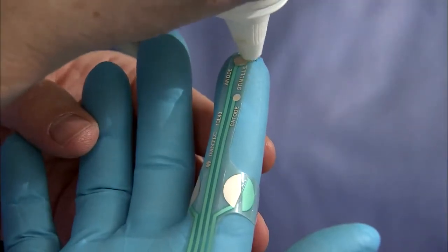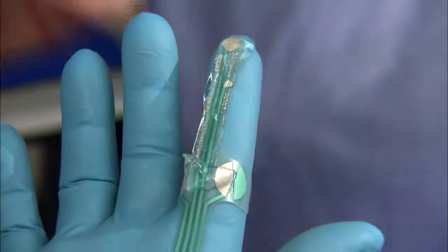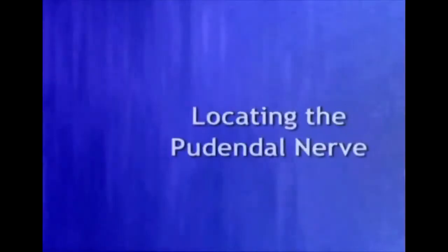Now that the electrode is in proper position, we're going to apply lubricating jelly to the index finger to ease insertion of the finger into the anus. It is critical that the St. Mark's electrode is placed directly on top of the pudendal nerve on both the left and the right side. Here's Dr. Jamie Merrill to explain to you the proper technique of finding the location.